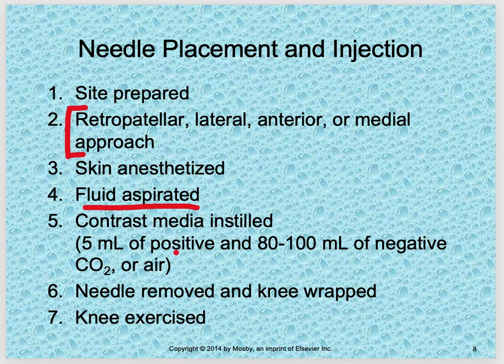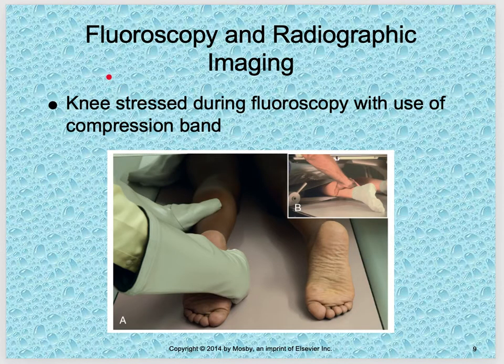So your contrast media, 5 mL of positive, 80 to 100 milliliters of negative CO2 or air. And the contrast media, once again, is dependent on the clinic site, what they're going to do, what their protocol is for. Usually it's just the contrast media. And then remove the needle and take care of the knee, and then send them to CT or MRI, depending on where their next order is for. So fluoroscopy and radiographic imaging.